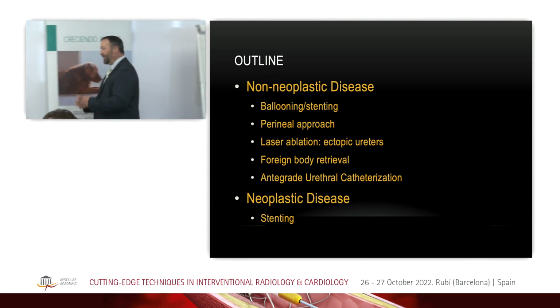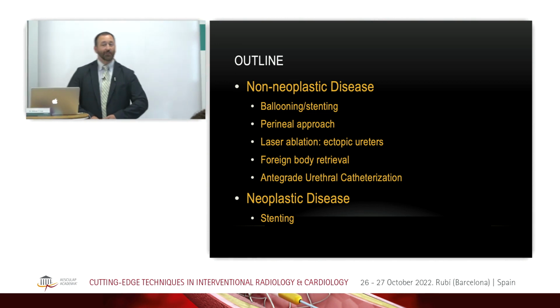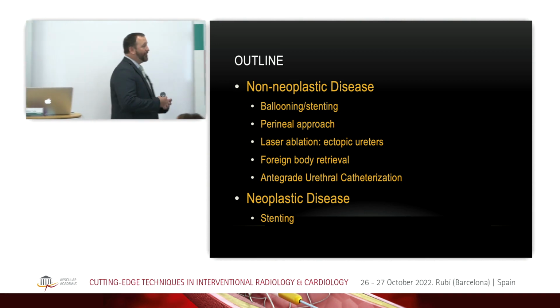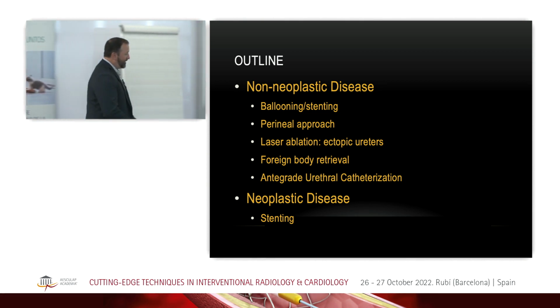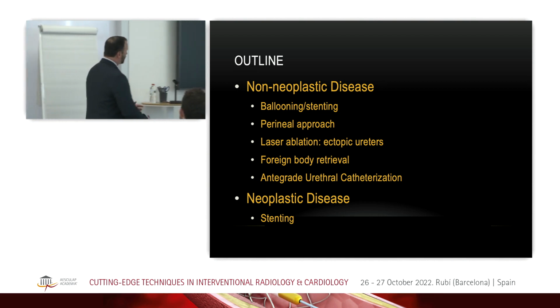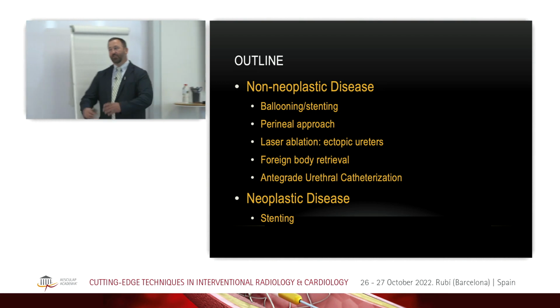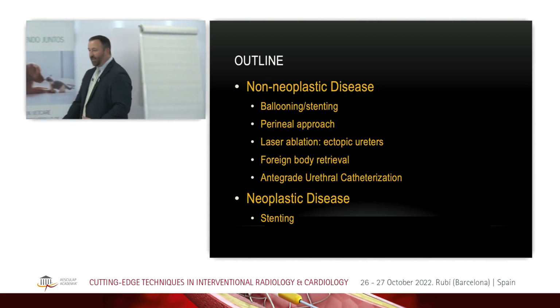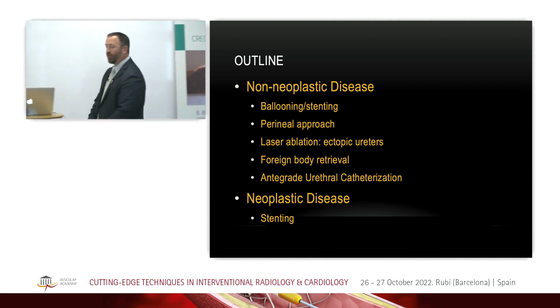One of the big things that's been, I don't want to overstate this, but almost life-changing, at least in the area of de-obstructing cats, is just the use of guide wires. Makes it so much easier. Guide wires want to go past obstructions, and so using little guide wires just dramatically improves some of the things that we can do in our cat patients. So just something to think about. That's a case that we all see every day, cats that come in obstructed from lower urinary tract disease.